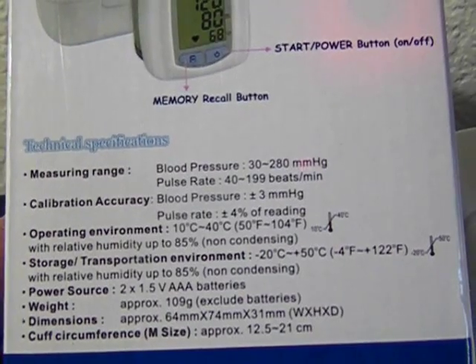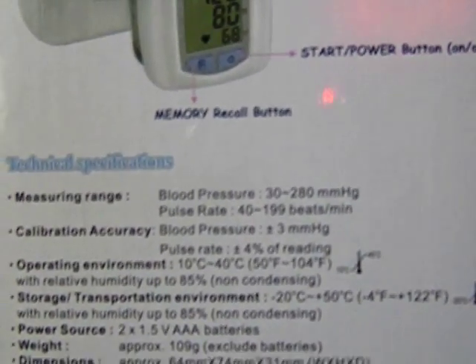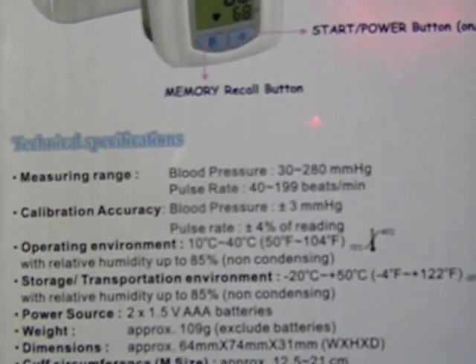Calibration accuracy for blood pressure is plus or minus 3 mmHg. For the pulse rate, it's plus or minus 4% of the reading.